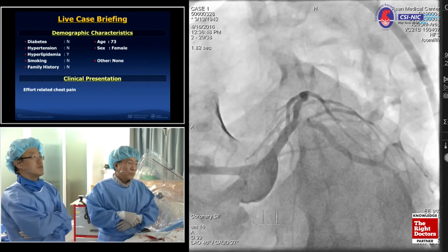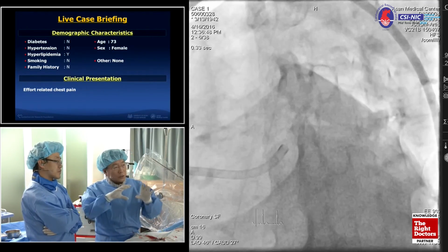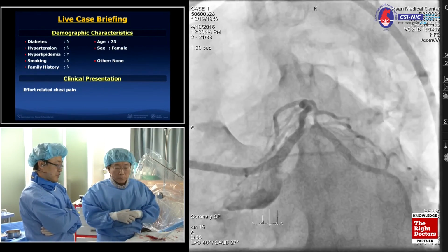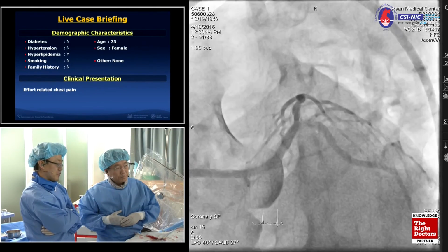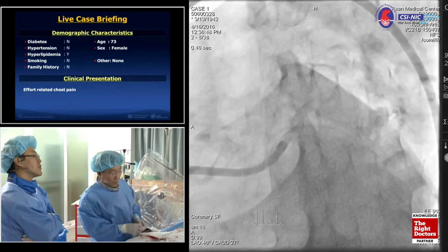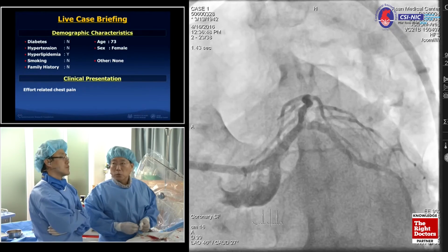Right. You mean the Triton stent. To be honest, I don't have any experience with the dedicated stent. You suggest the Triton in the circumflex? Yeah, and then that gives you opening to the LAD, and then it becomes almost like a culotte, but without having to put more metal in the left main. I see. All right. I think that is another option. However, frankly, I have no experience with that.